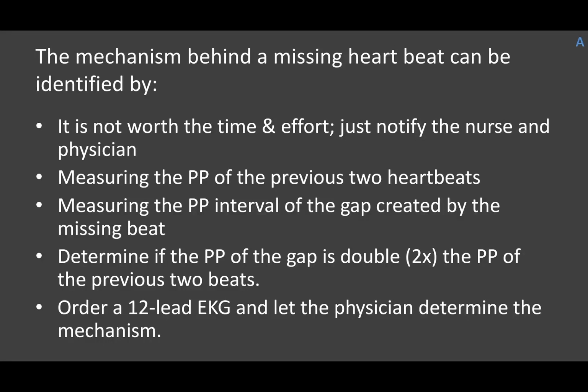The mechanism behind a missing heartbeat can be identified by which of the following? It's not worth the time and effort, just notify the nurse and physician. It's good enough. Yeah, I'm going to say that's not the right attitude. Measuring the PP of the previous two heartbeats? Absolutely. Think back to our sinus blocks and our sinus arrests. That's what we're focusing on for these questions.